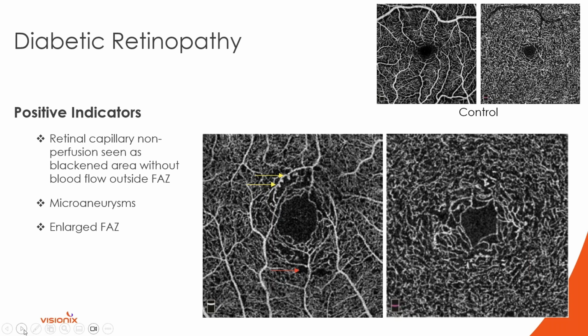On the top right, I have the image of the superficial and deep capillary plexi. Why? Because those are the two plexi that feed the superficial retina, or the sensory retina, okay? So when you're dealing with intraretinal disease, it's not all that important to be looking at the avascular and choriocapillaris slabs. We want to be looking more at these two slabs that feed the sensory retina. So in diabetes, these are the slabs of interest. So what are we looking at?